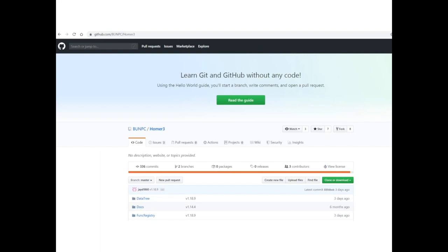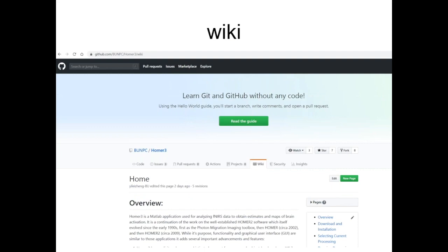This is the GitHub page for Homer3 — everyone can download it. I highly recommend using the GitHub Desktop application so you can easily update Homer3 in your local directories. We also have a wiki there. The wiki is not that extensive right now, but we are working on it. A PhD student, Yele, is putting content there and it will build up over time.